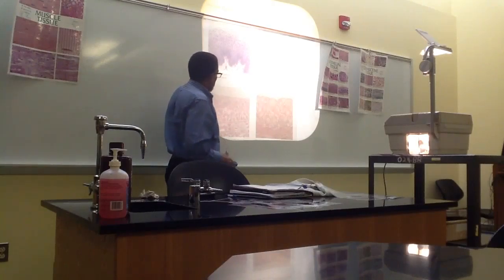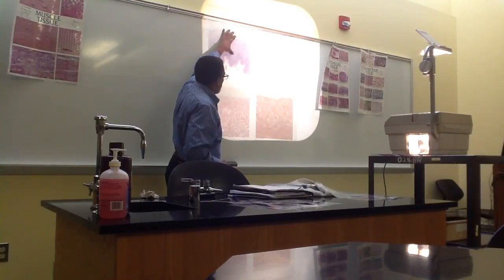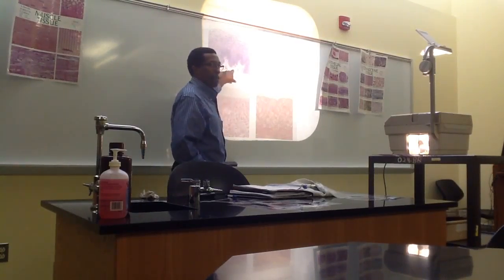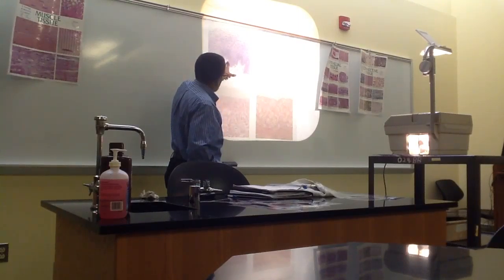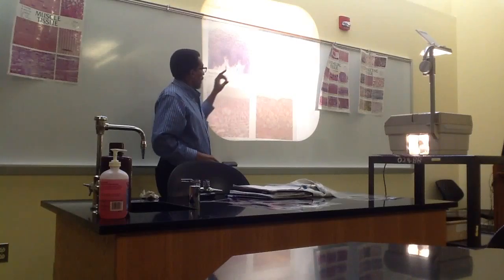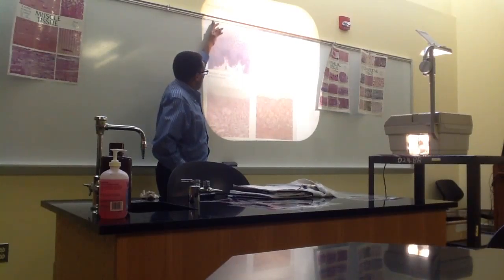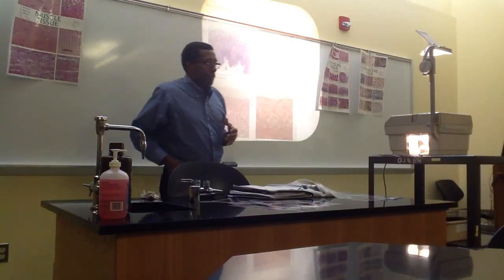It's not so much going to be a clear-cut line, but it's going to be a change of one type of tissue that stains one way and has certain characteristics in common from another type of tissue that looks different. All right? And so when you see this happen and the free space is on one side, and then you've got this basement membrane on the other side, that's going to be a second thing that tells you that this must be epithelial, the free space and the basement membrane.